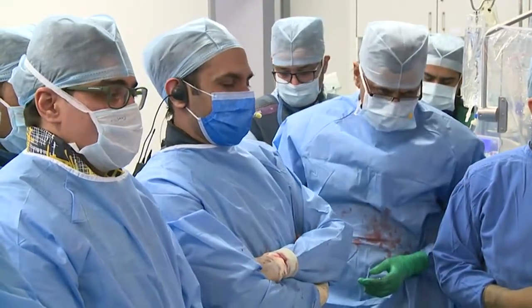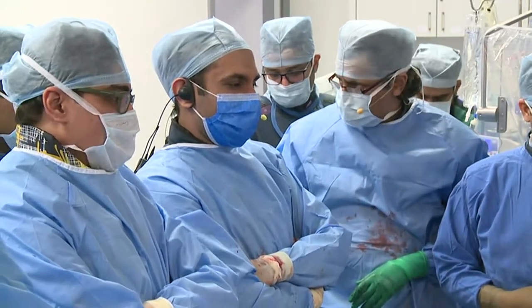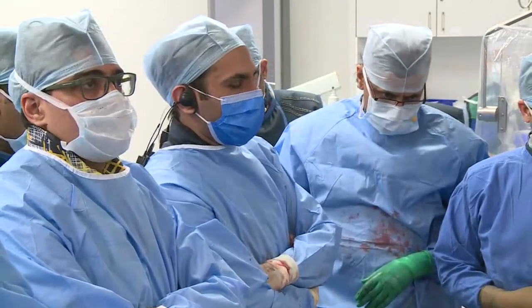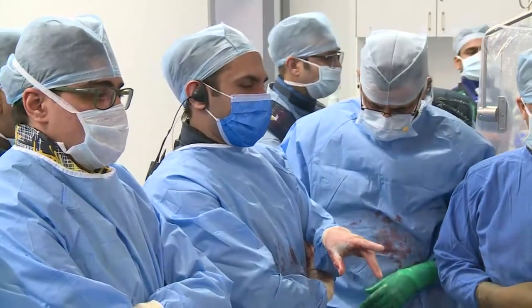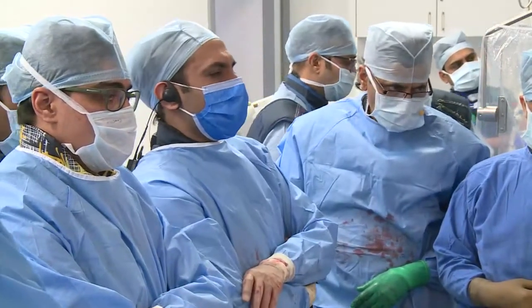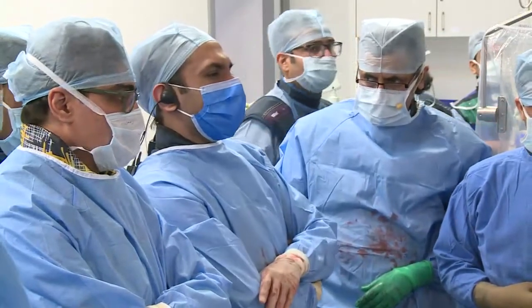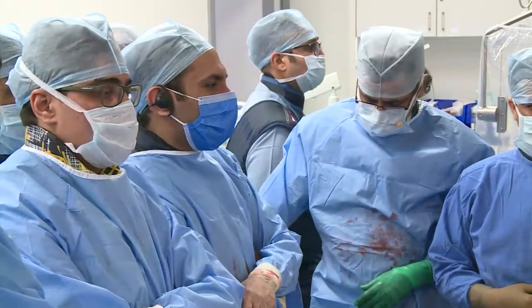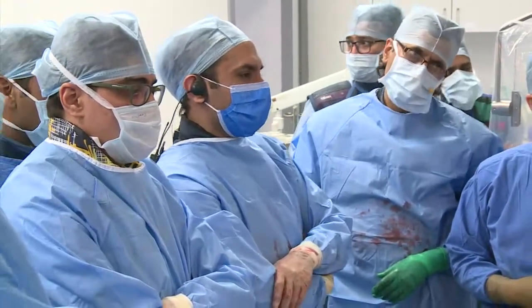May I ask you, what was the temporary wire used? Was it a balloon tip or just a regular one? Yes, it's a balloon tip pacemaker. We always use a balloon tip pacemaker. But what we do here in our center is, we inflate our balloon, we reach the RV apex, we check our parameters, and then we deflate it. The reason is, sometimes if you leave the balloon inflated, it can float up when you are trying to deploy your valve.